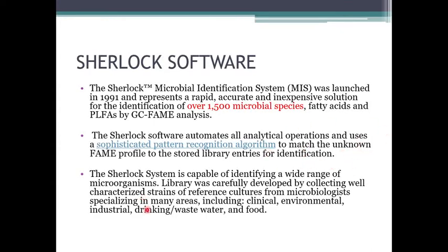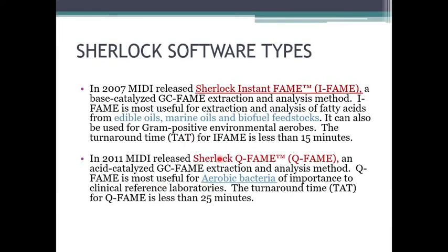And this software is capable of identifying a wide range of microorganisms, as this library was carefully developed by collecting well characterized strains of reference culture from microbiologists in many areas like clinical, environmental, industrial, drinking water, wastewater, and food samples. There are two types of Sherlock software.